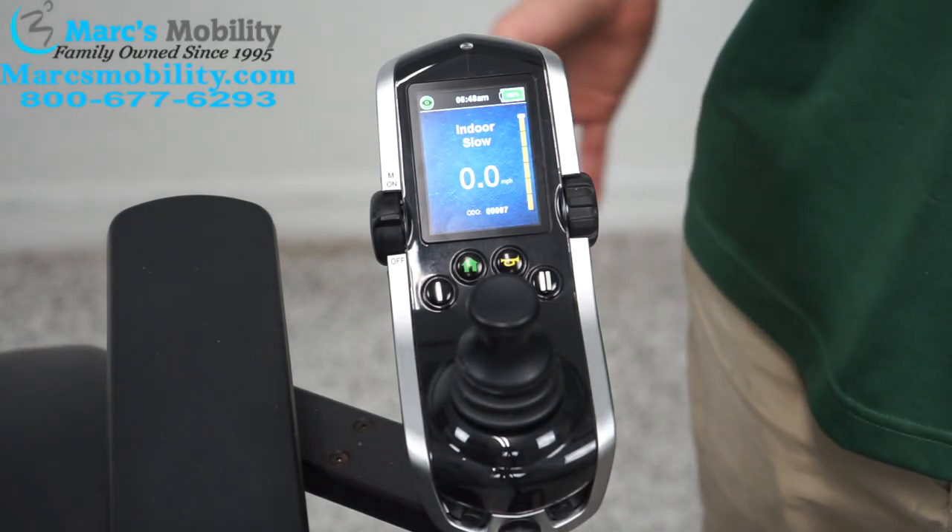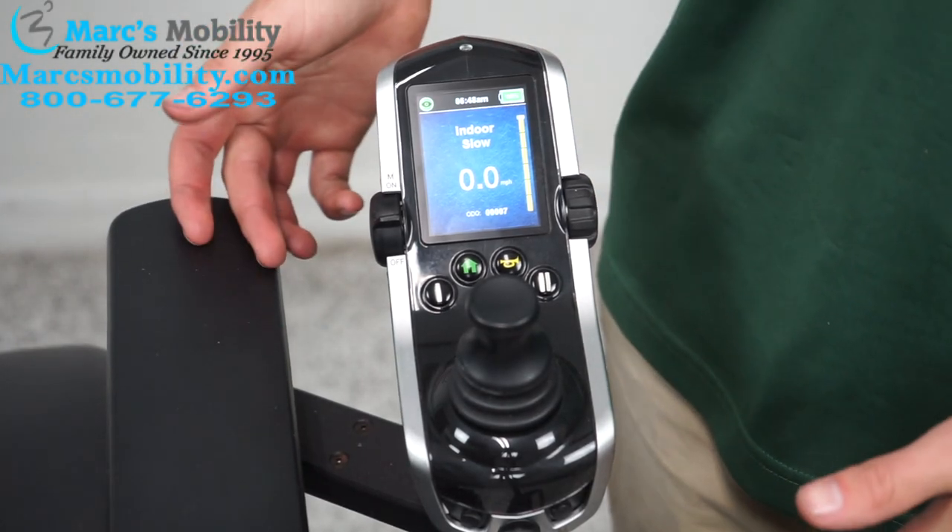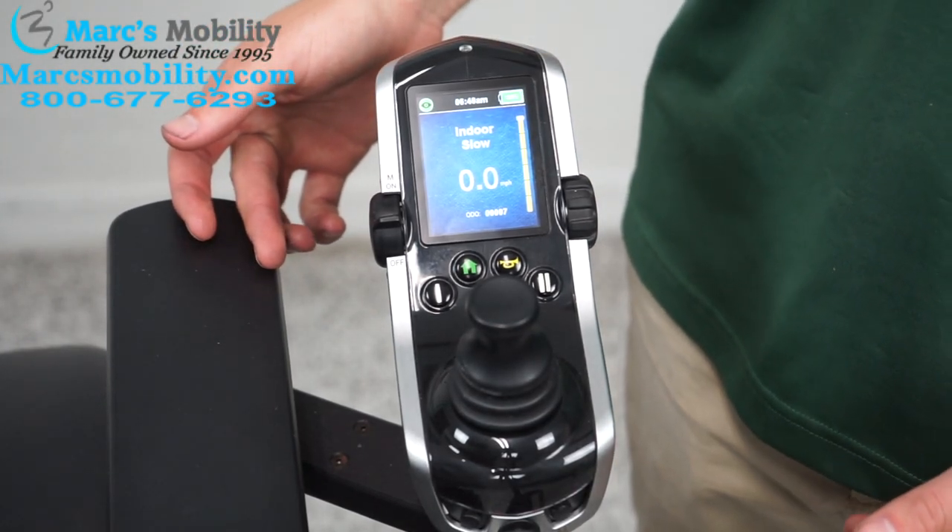Today I'm going to show you how to operate the Q-Logic joystick. This joystick is present on most Quantum power chairs.